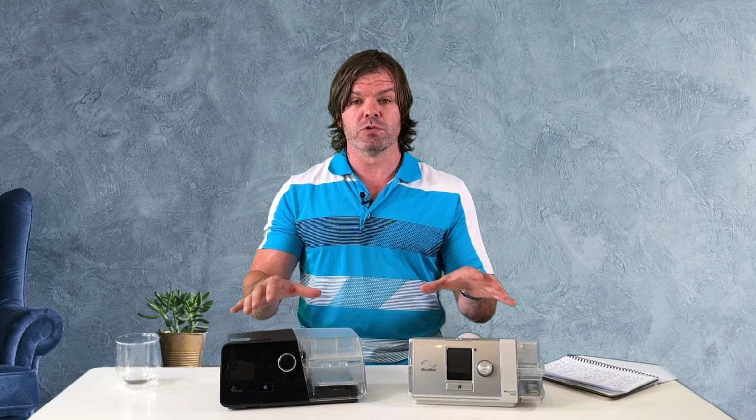But another really important thing is you want to know what happens after that warranty. What happens if your motor blows up, and do they have fixed price servicing? Is there just one price no matter what the fix is, or is it on a quote basis? Just find out a little bit about the warranty, but ideally you want a 5-year warranty on these full size units. You're probably not going to get that on the travel size units. And also you might want to discuss with the manufacturer or where you're buying it from, is there an option to pay an extra $100 and get a few more years on top of that? So warranty is certainly one to take a look at when you're choosing your machine.